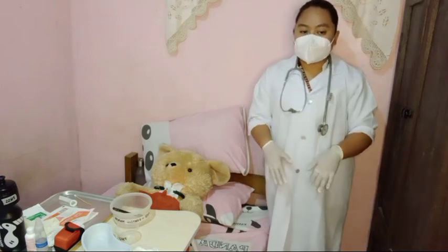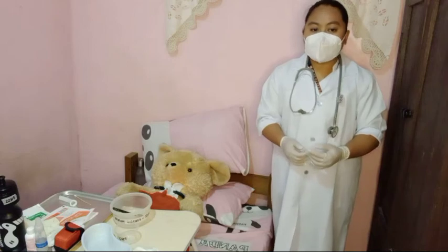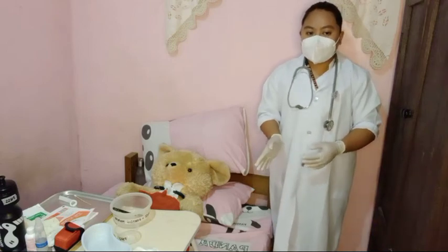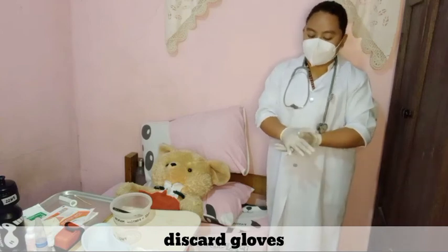Remove gloves and assist the client in a comfortable position. Raise the bed rail and place the bed in the lowest position.